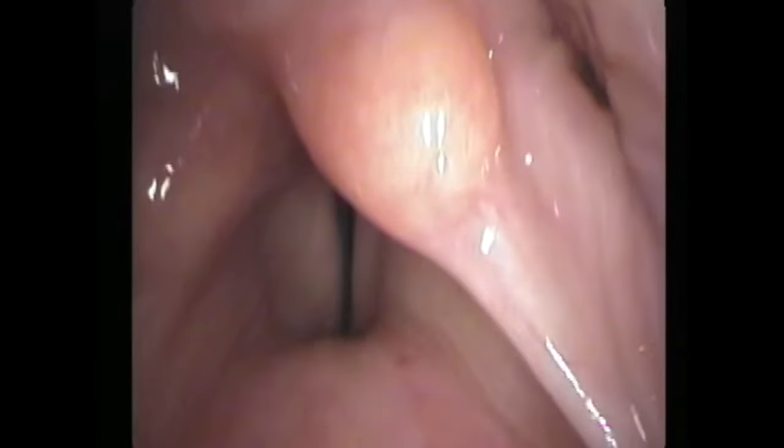It's even more apparent her dysfunction during respiration - when she breathes out (expiration), the vocal processes should rotate. We see the right side rotating, while the left fails to rotate very much at all. And this is another great view of how on the right side the vocal process is rotating and leading the closure, while on the left side it is not rotating, and it's being dragged towards the middle.